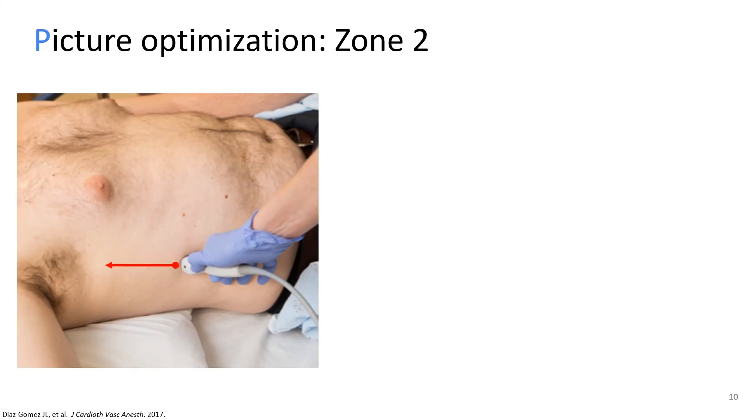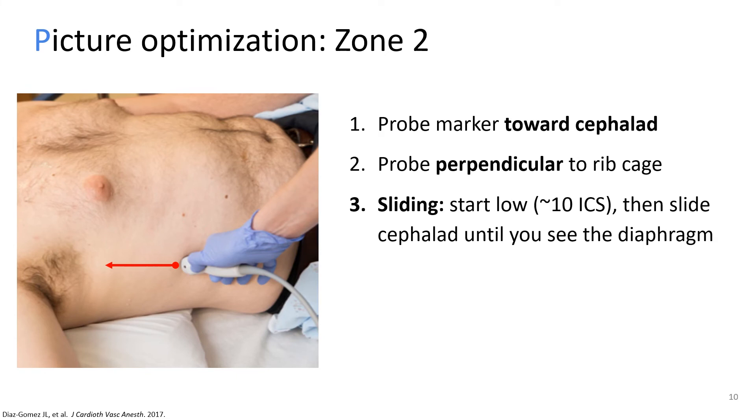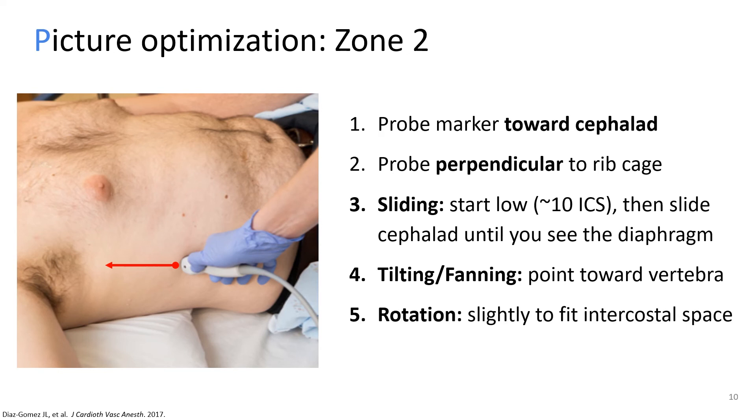For zone two, the first two steps are the same as previously described. The probe marker should point towards cephalad or 12 o'clock, and it should be perpendicular to the rib cage or chest wall. Then you should start scanning lower at around the 10th intercostal space, and then slide cephalad until you see the diaphragm. Next, you can tilt or fan your probe such that you direct the ultrasound beam towards the patient's back, thus scanning over the posterior area of the costophrenic angle where pleural fluid will accumulate. And finally, you can rotate your probe a little bit to improve your view, since the ribs over zone two will have a diagonal orientation. You're just trying to sneak in between these two ribs to see what's inside.